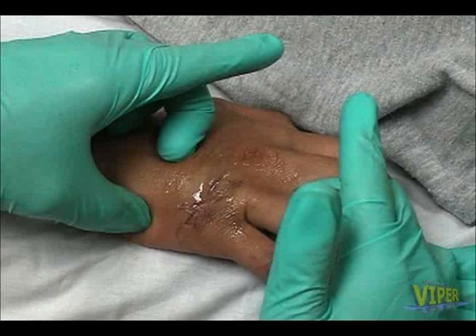Finally, have the assistant slowly peel his or her fingers away from the field, being careful not to pull off some of the adhesive.